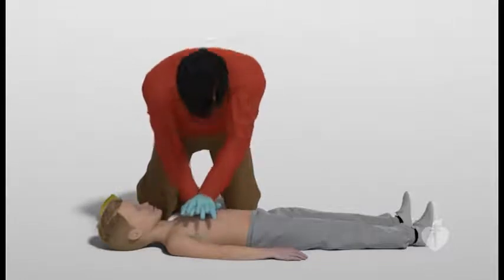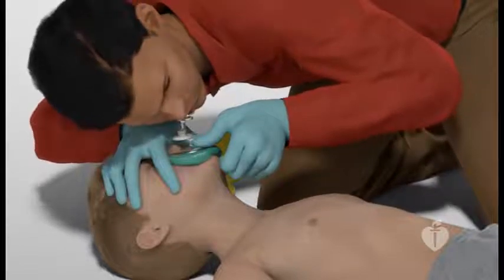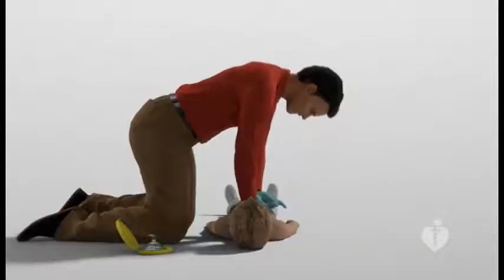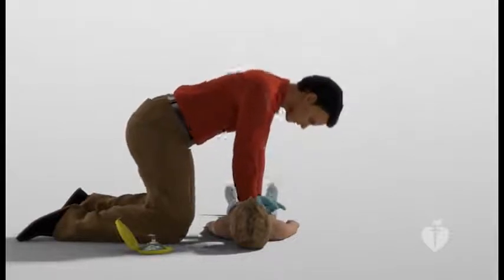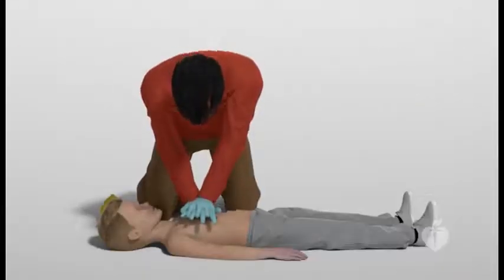After 30 compressions, quickly give 2 breaths. Do sets of 30 compressions and 2 breaths. Remember to give the 2 breaths in less than 10 seconds to minimize interruptions in the compressions. If no one has come to help and you don't have a phone nearby, after 5 sets of compressions and breaths, leave the child to phone 911 and get an AED if available. Return to the child and use the AED immediately.